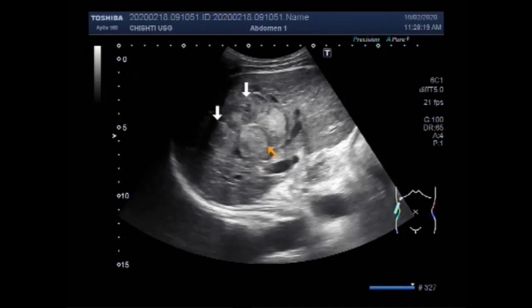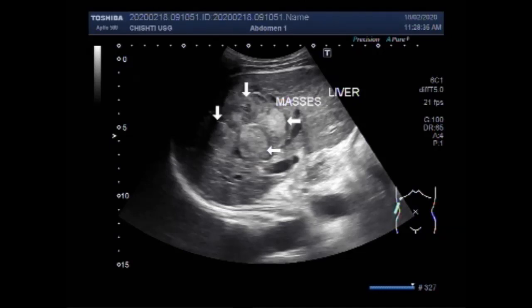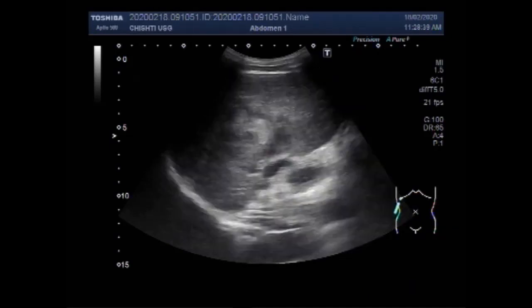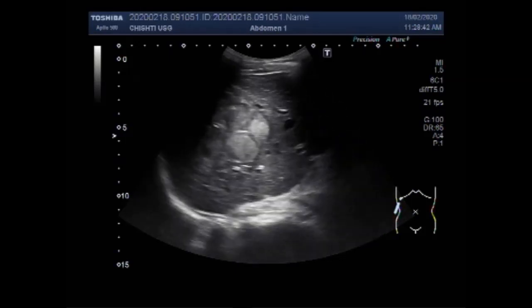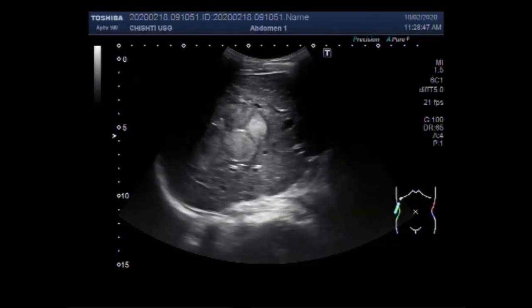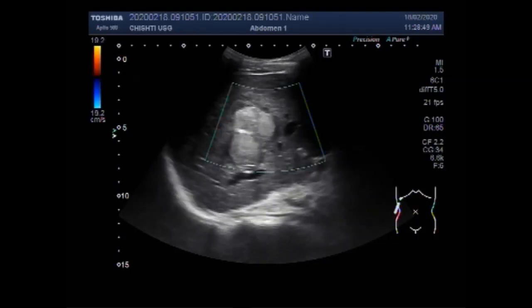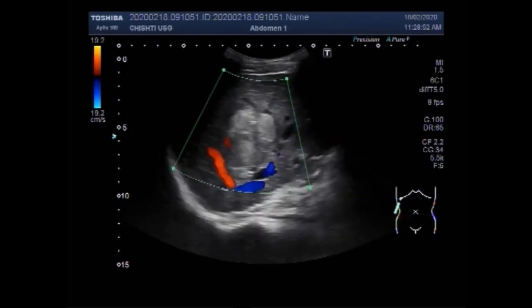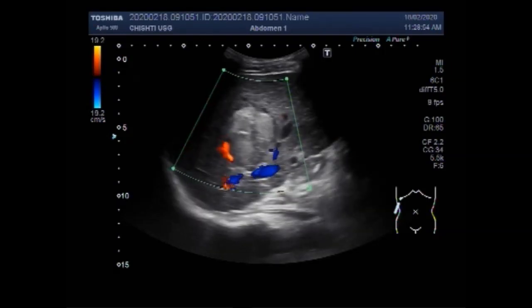You can see a bunch of multiple masses. This mass is round to oval in shape. No significant fluid is seen in the interior of the mass. You can see blood flow inside the mass.